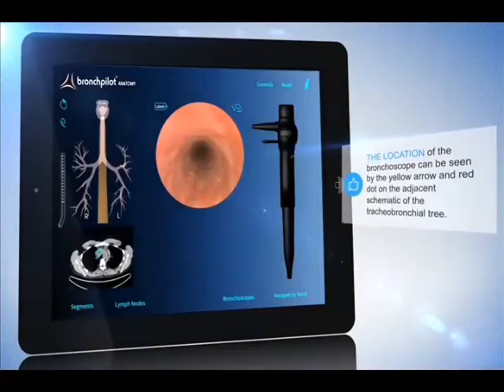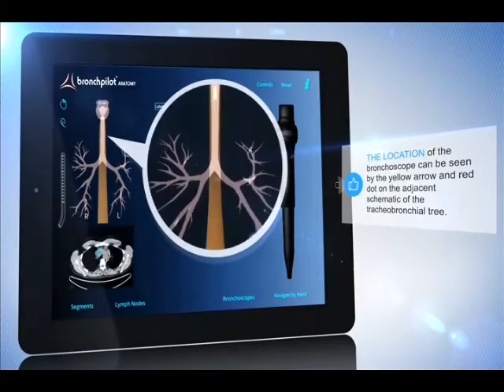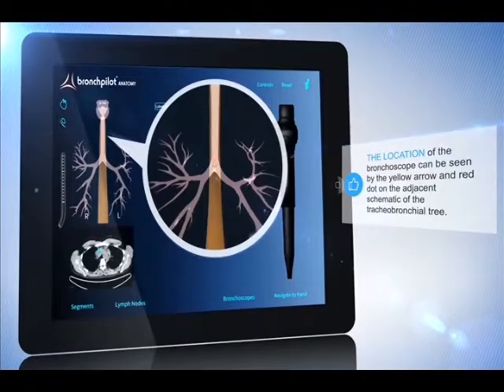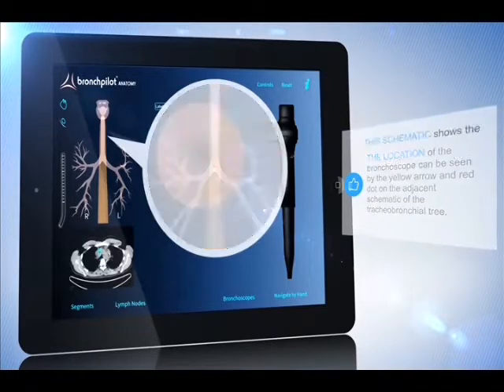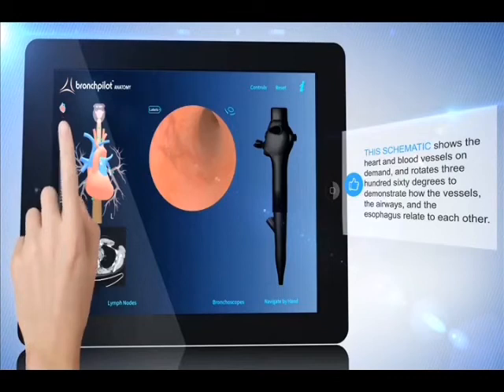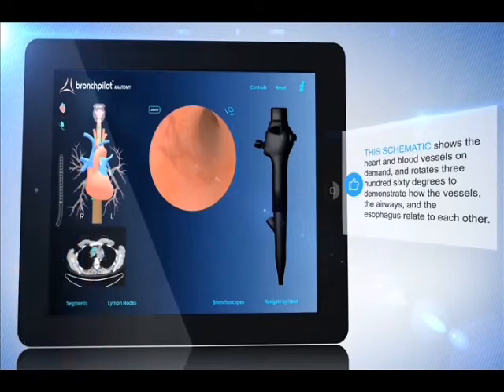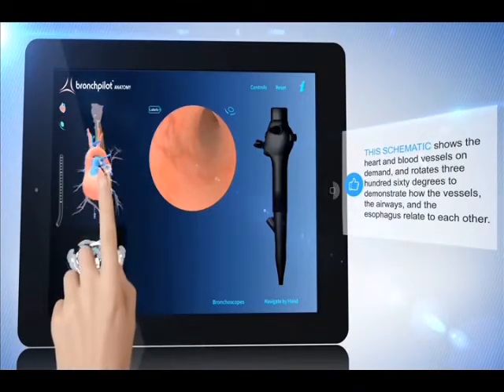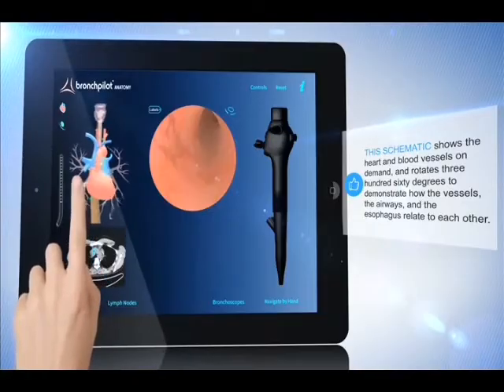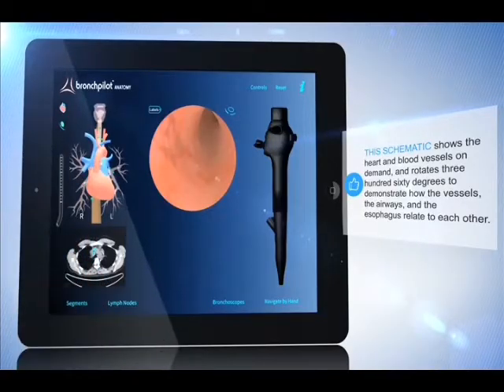The location of the bronchoscope can be seen by the yellow arrow and red dot on the adjacent schematic of the tracheobronchial tree. This schematic shows the heart and blood vessels on demand and rotates 360 degrees to demonstrate how the vessels, the airways and the esophagus relate to each other.